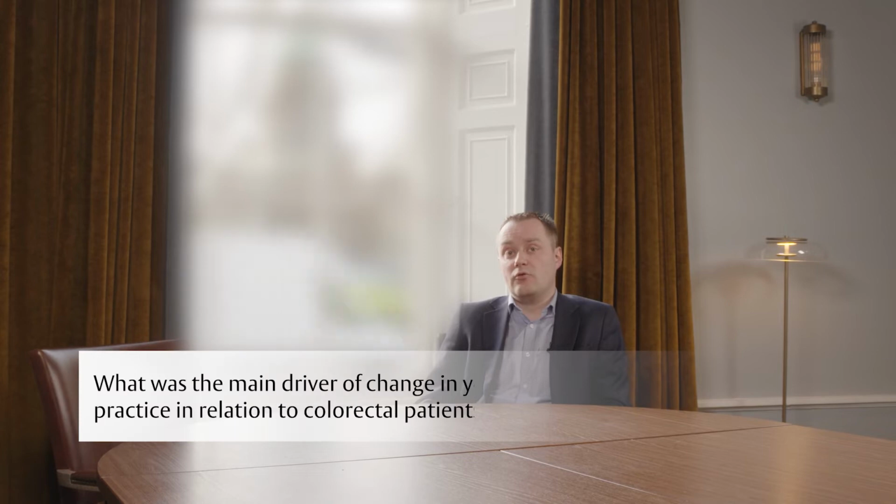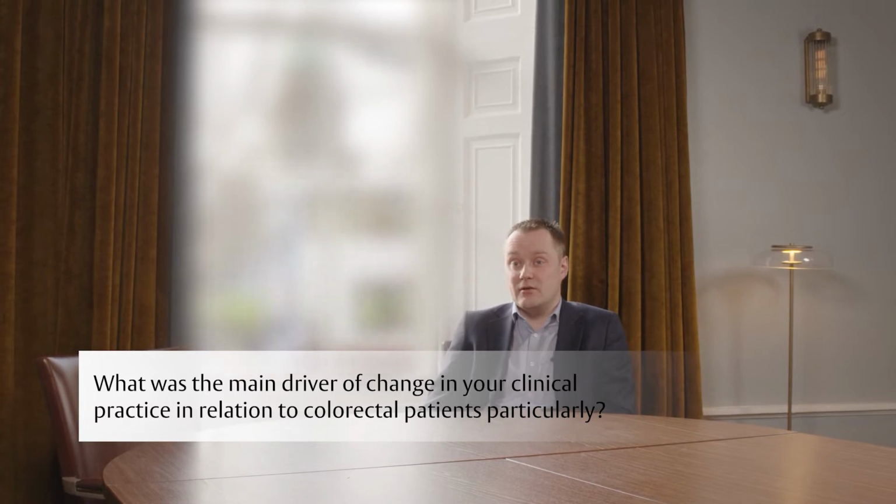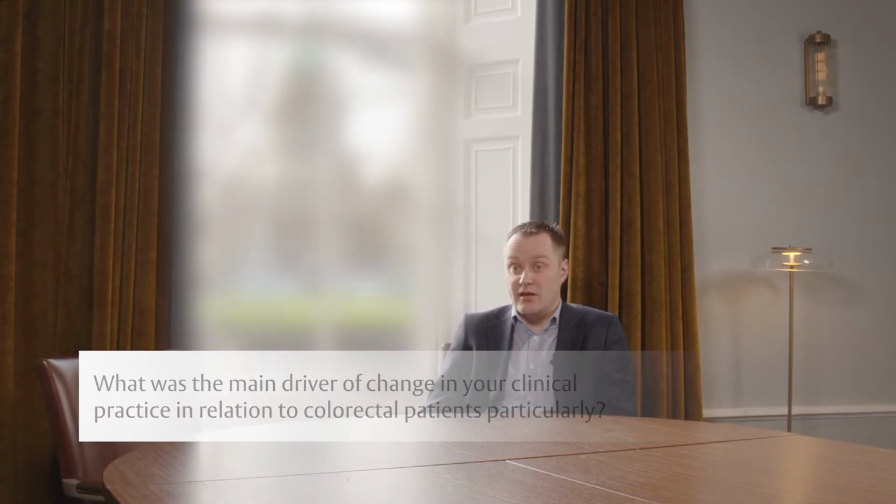So I think that over the last few years there's been an increase in the amount of evidence suggesting that any periods of hypotension during an operation is bad for the patient, and outcomes can be affected substantially, not just by individual events of hypotension, but actually the cumulative periods of hypotension over the course of the whole procedure. And so I think myself, along with many colleagues across the world, clearly have been reading and reviewing this type of research with interest to see how does this affect the patients that I care for and look after.